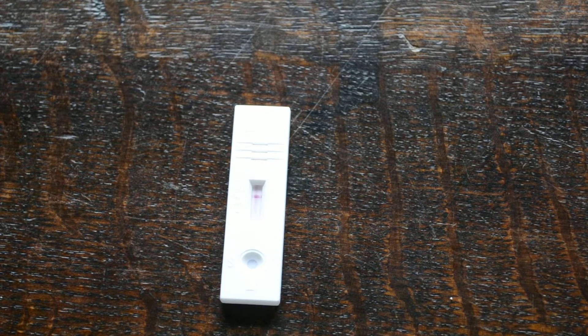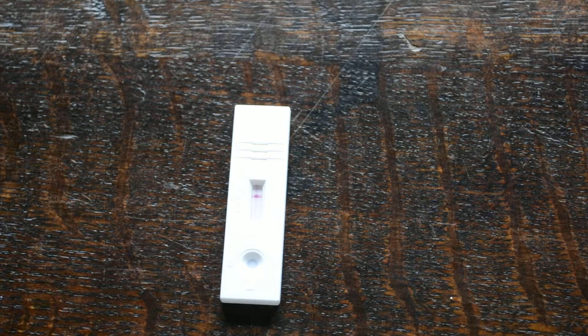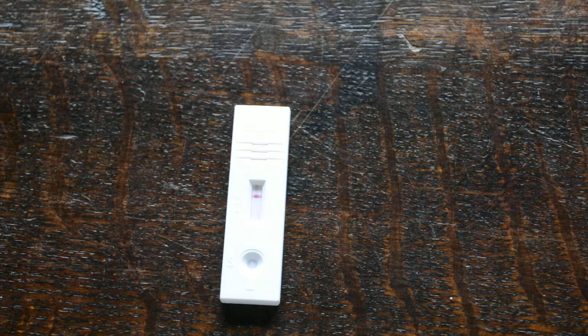These test membranes — this one is marked as a 25 MIU standard membrane. They are also manufactured to a sensitivity of 10 MIU (milli-international units) of HCG, and that format is referred to as an ultra pregnancy test. Testing for lower levels of HCG means you can detect a developing pregnancy earlier, but a small percentage of those early pregnancies won't implant properly and won't continue. So if you're using ultra membranes, confirm the pregnancy 24 to 48 hours later using a standard 25 MIU membrane to confirm the pregnancy is implanted and continuing normally.